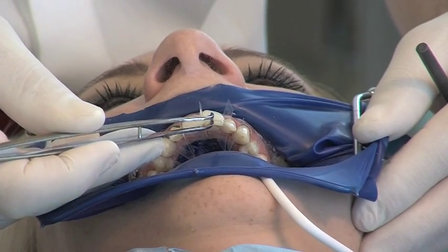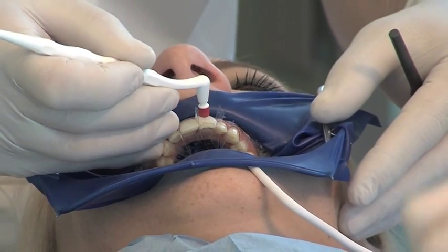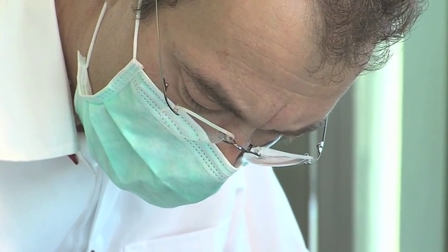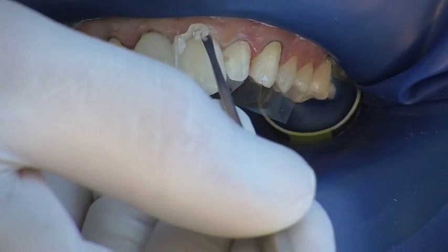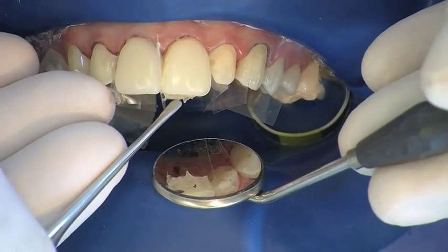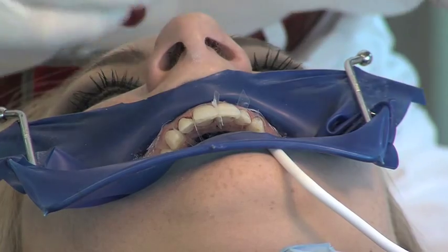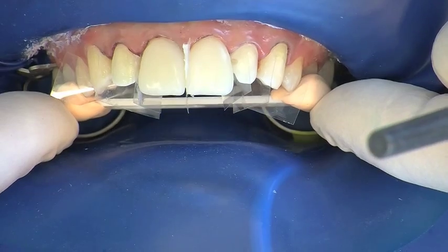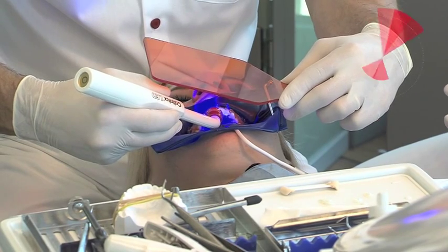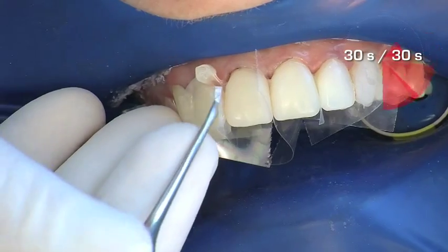When placing several Componeers, it is recommended that the first Componeer should not be light cured. The second Componeer is placed in the same way as the first and aligned to it. The position of the Componeers is checked or corrected using the prepared occlusion index. With the Componeers in the correct position, they are light cured — firstly palatally and then buccally, each for 30 seconds.